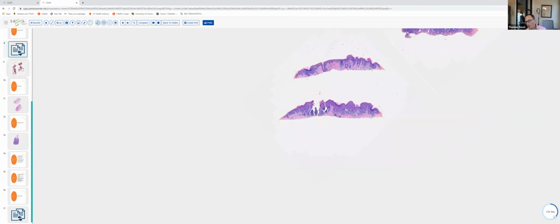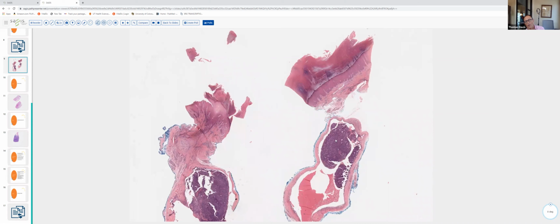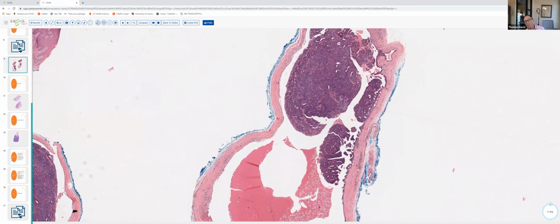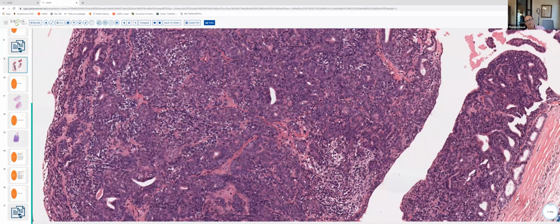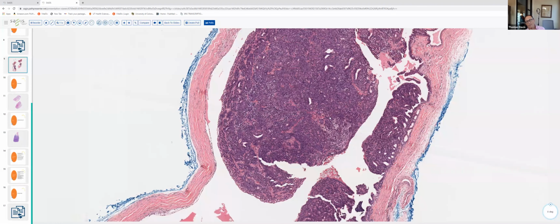Now, another tumor that enters into the differential diagnosis with our Hidradenoma papilliferum is a digital papillary adenocarcinoma. And one can see in this biopsy from acral skin, very thick cornified layer, we have this dermal tumor situated in a portion of the dermis that one frequently sees hidradenomas. And this also has numerous papillary projections. But a digital papillary adenocarcinoma typically is much more cellular. The glands are more tightly packed, and generally one will see more nuclear pleomorphism, mitotic figures, and necrotic cells, although the degree of atypicality can be somewhat variable.